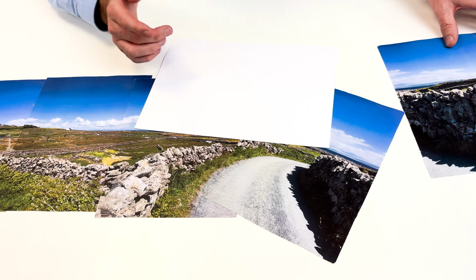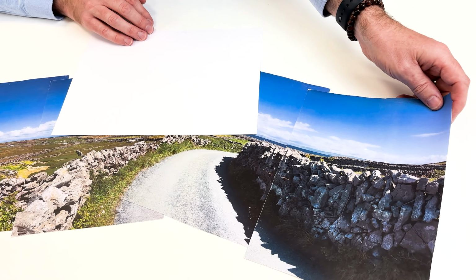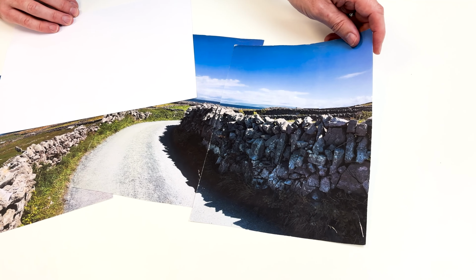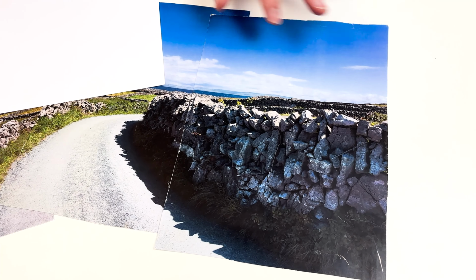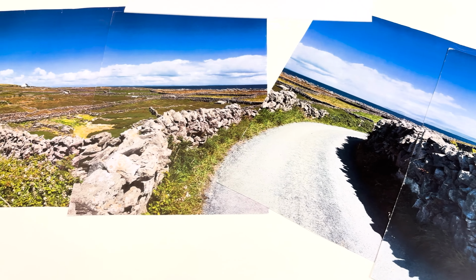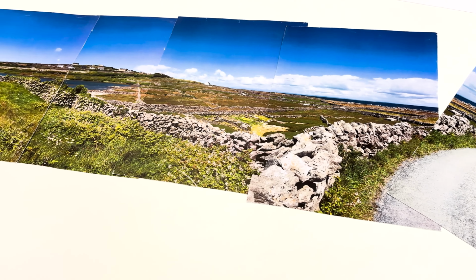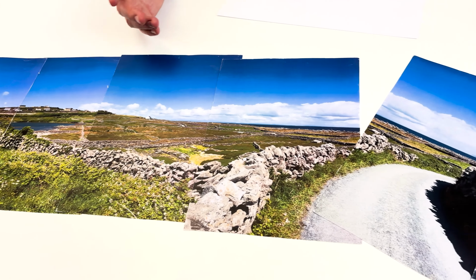Then we go back on path as we move around the arch, and the scanner sees, okay, well, here's some more information. Let's add it on here and line things up, and that's great. And you can imagine then, as if we were to continue that, we could end up with the scanner going off on a completely different trajectory. And I'm not going to say it's a common thing.